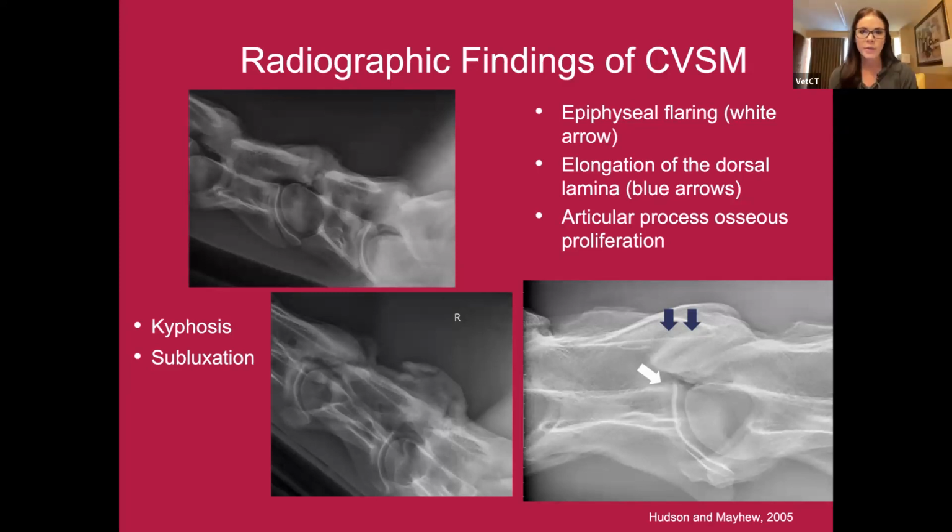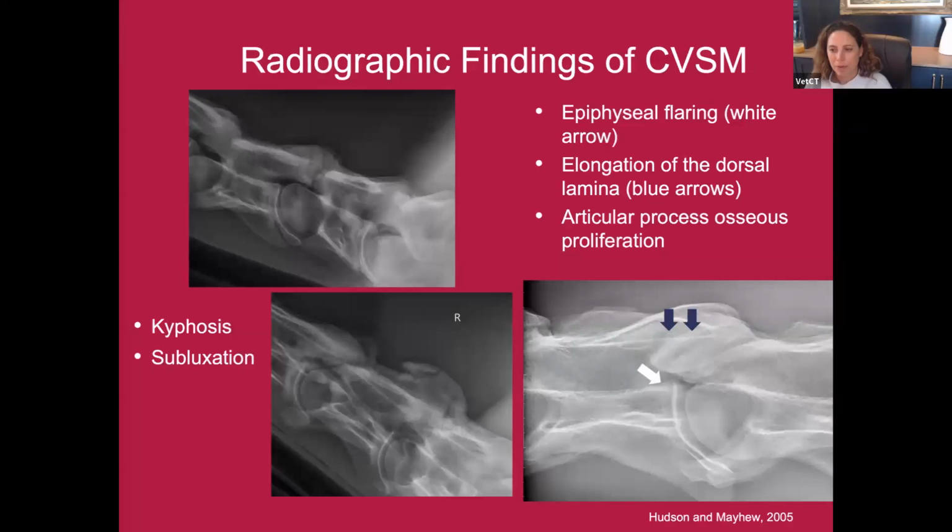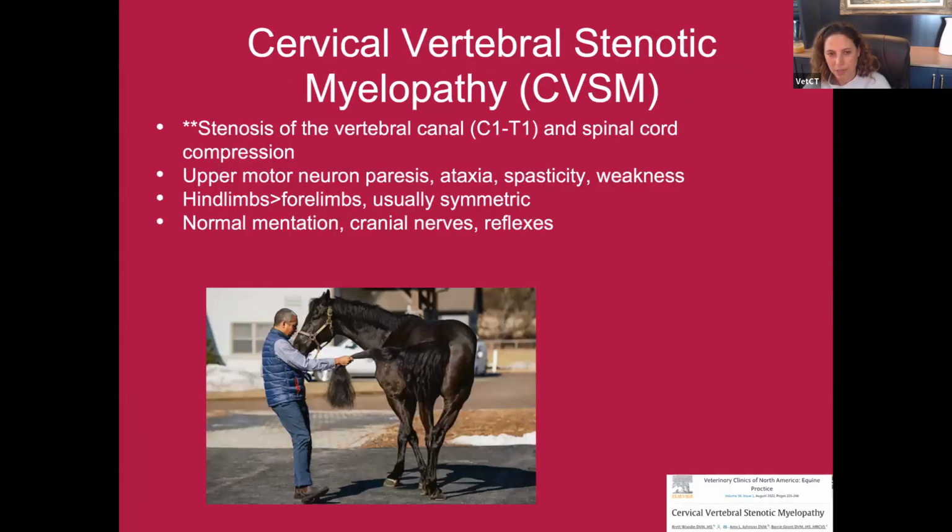Okay. I think we've got time for one more question. What about if contrast does not go all the way down the spine? We have problems sometimes, even if we try to move the neck. So my question would be, what strength of contrast are you using and what dose? I know it's probably hard to answer, but I can tell you my suggestions.